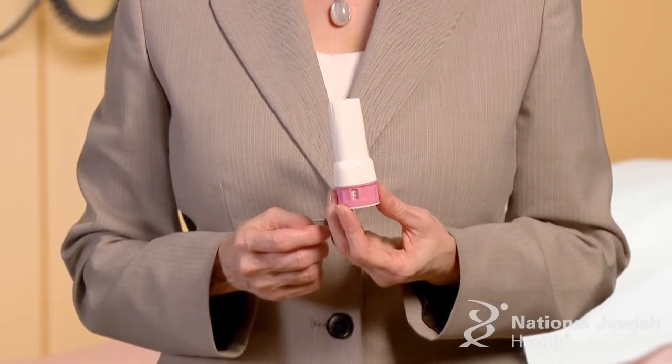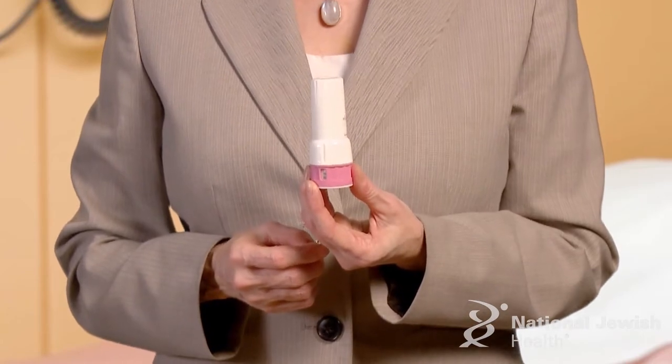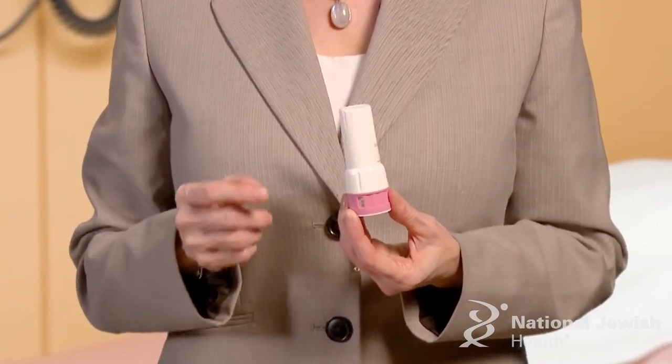The twist hailer has a dose counter on the pink base. It will let you know how many doses are left. As you turn the twist hailer cap to take it off, the dose counter will count down by one. The twist hailer will count down to zero when it is empty.